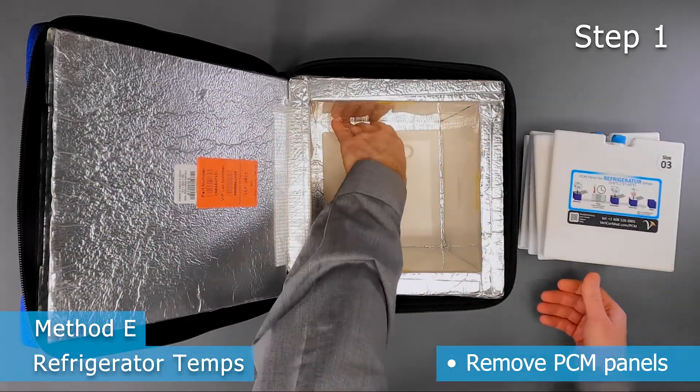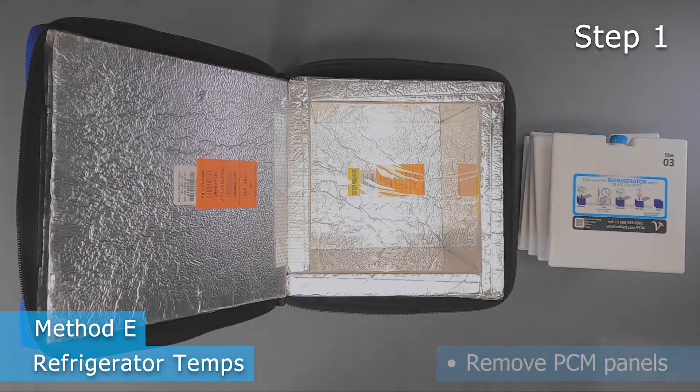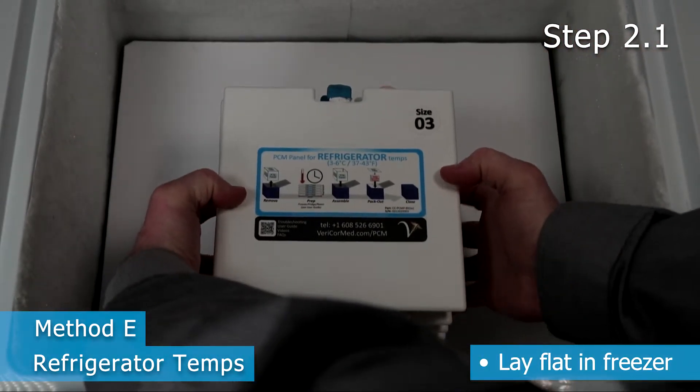Step 1: Remove the PCM panels from the CoolCube. Step 2: Lay the panels flat in a freezer. Make some space around each panel for even cooling.